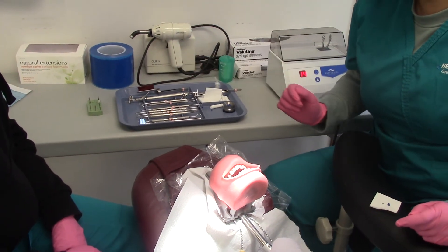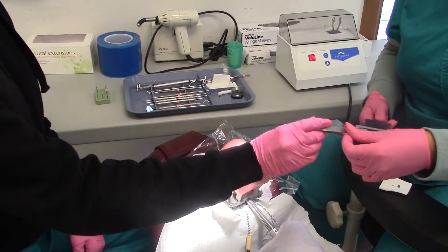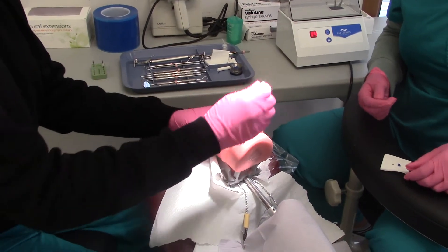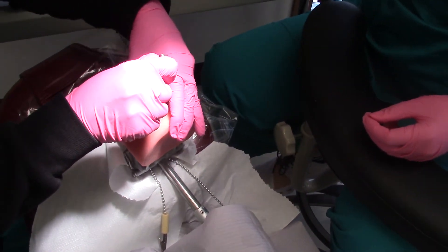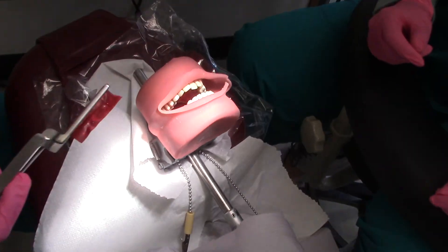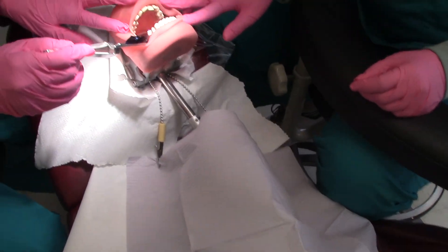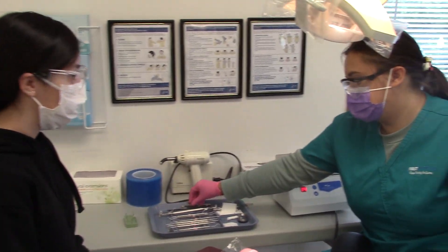Now you'll need the articulating paper to check the bite. Is it good? Yeah. And that's our lovely students practicing in Melbourne.